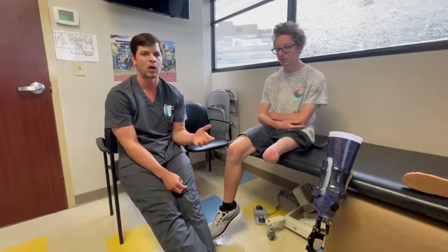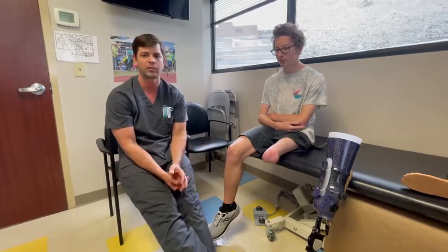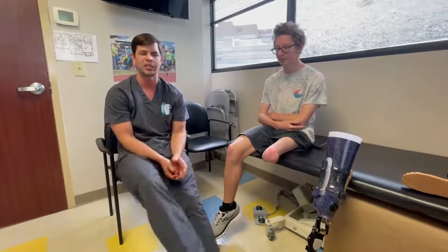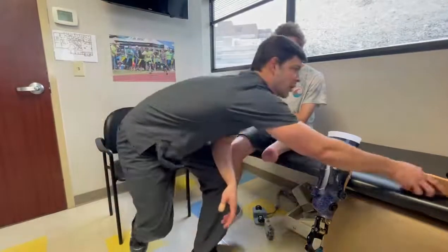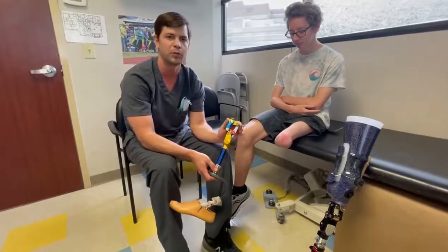He has acclimated quite well to the system and has been very successful for the last two years. I haven't seen him in two years — he's been in the same socket, same knee, and same foot. When I first saw him, we transitioned him to a pediatric All-Pro foot and a Total Knee Junior.